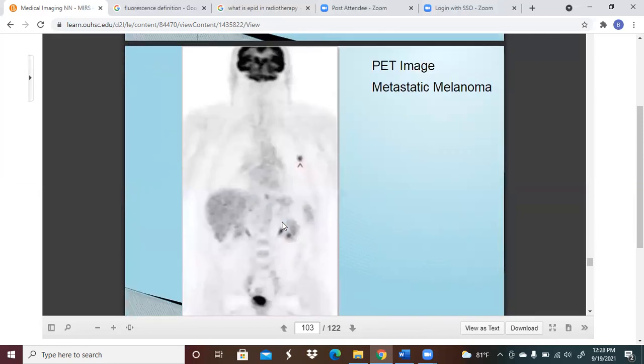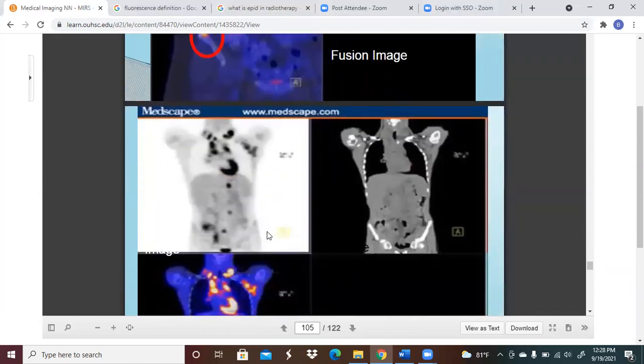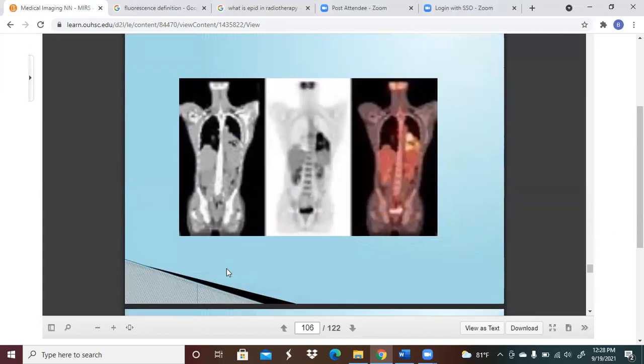You combine that information with a CT. So you got a CT image here, you got a PET, which is a lot of what I can do during the day. And you can match up the physiology with the anatomy. And when you do that, then you can figure out how to plan in order to treat somebody. Oh, this person's got a lot going on. I mean, you can see stuff going on in the neck. Obviously, you got the heart over here, but you've got axillary nodes, it looks like, things going on over here in the lung, whatnot. That's not a good story.